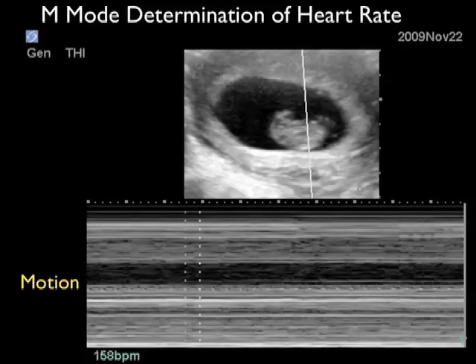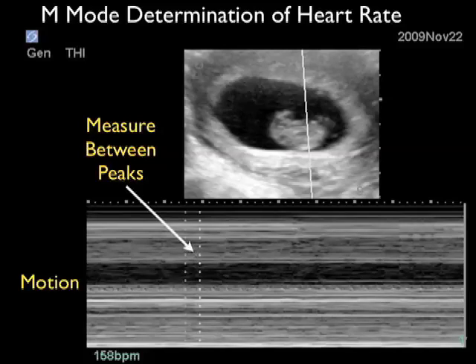Here we're going to use M-Mode to determine the fetal heart rate. Notice we have the fetus zoomed up towards the top of the image and we're placing the M-Mode caliper directly over the fetal heart. Towards the bottom, we see the M-Mode motion strip and the little waves showing the motion of the fetal heart. In this particular ultrasound machine, we measure between each peak and we can see a heart rate determination of 158 beats per minute. This is something we can print out and place on the chart to show that at the time we saw the baby, there was an actual heartbeat.